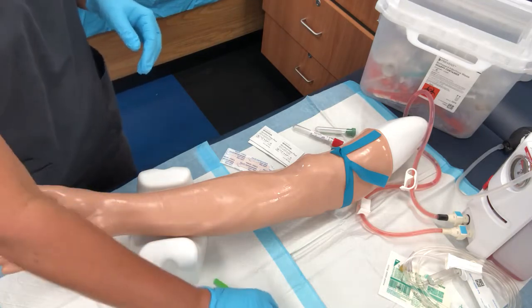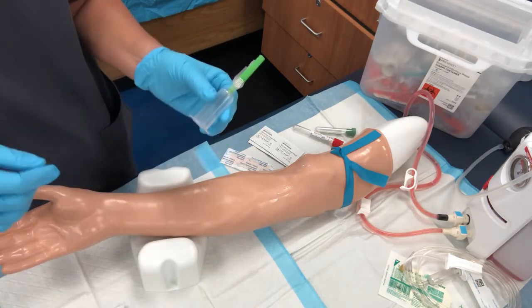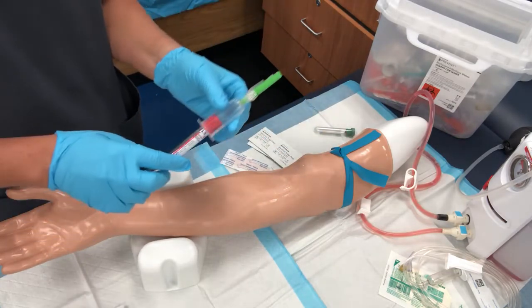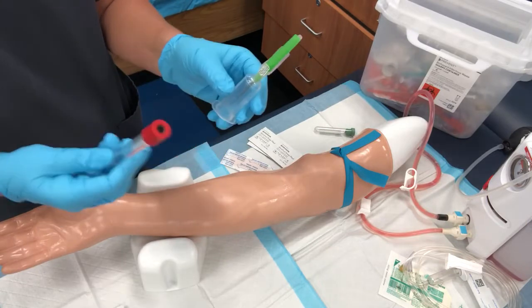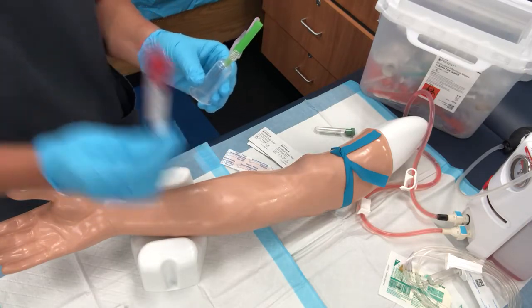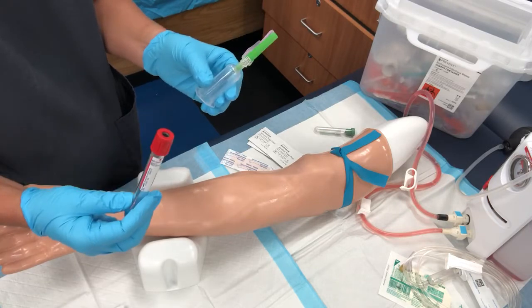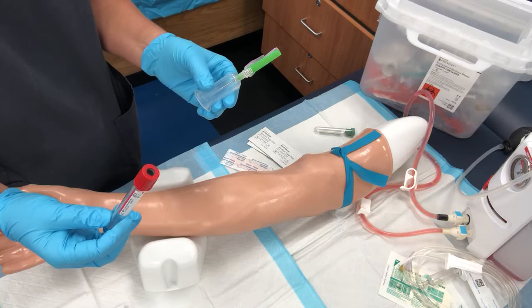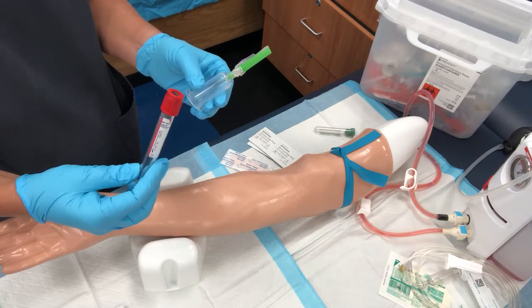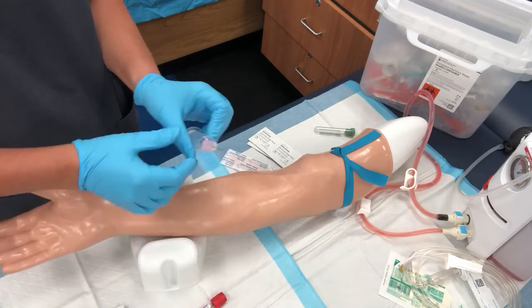And as it's drying, again, we've already assembled our needle with our adapter. And what you'll see people do quite often is go ahead and essentially get one of the tubes ready, meaning that you cannot puncture it with your adapter. If you do so, you have lost the vacuum in your vacutainer. And so you'll stick it in and you'll wonder, hey, how come I'm not obtaining any blood? It's because you have essentially lost the vacuum within the vacutainer.